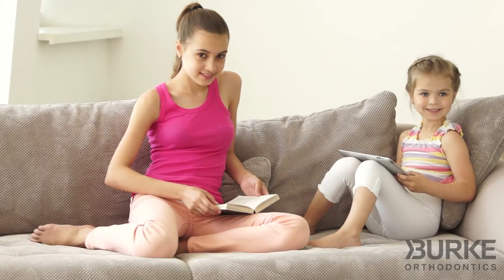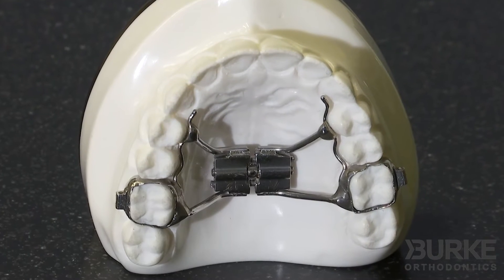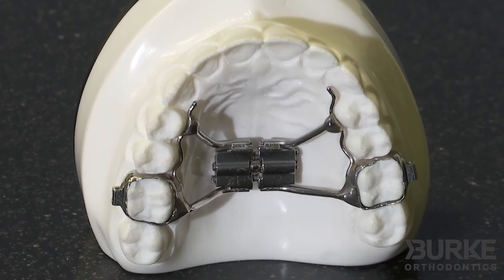Some children and teenagers have an underdeveloped upper jaw, or perhaps they have a crossbite, or maybe severe crowding. All of these orthodontic problems can be corrected with what's called a palatal expander, or sometimes simply referred to as an expander. It is a relatively painless process and is tolerated extremely well by our patients.